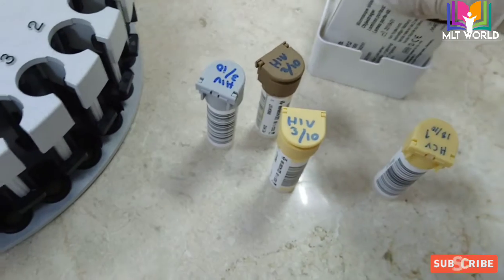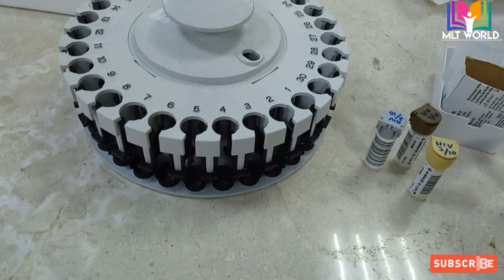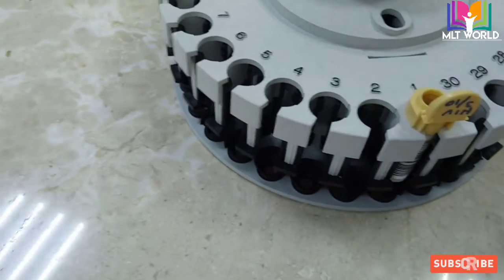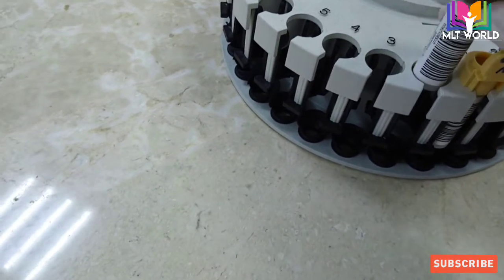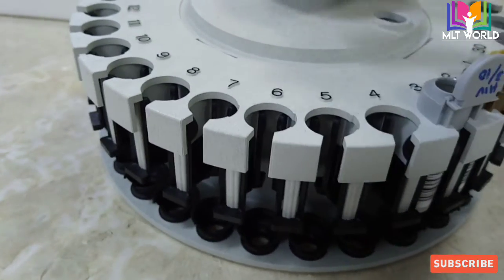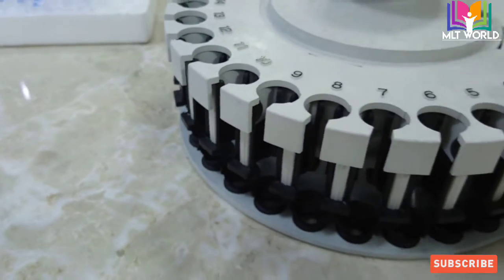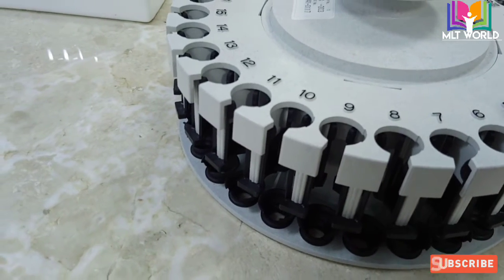After settling, we will keep controls in the machine. With every reagent there are two controls to run, but for HIV there are three controls. It is your choice to run controls first and then samples, or run both together. Keep the barcode facing the front so the machine can read it. You can keep controls in any sequence order. Normally, at the start of each shift, we must run controls at least once to check the quality of our reagents and machine.